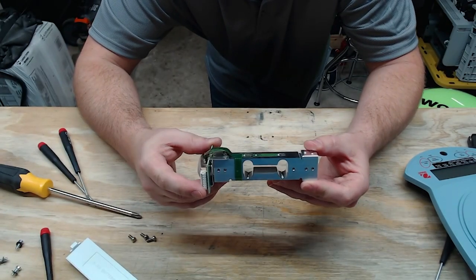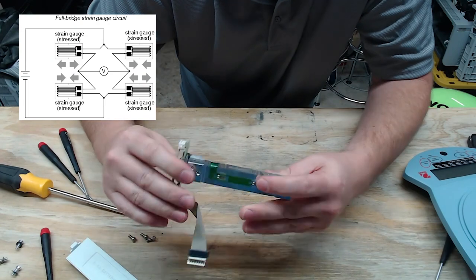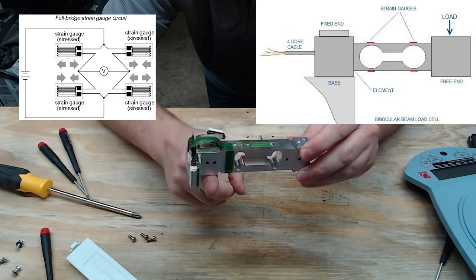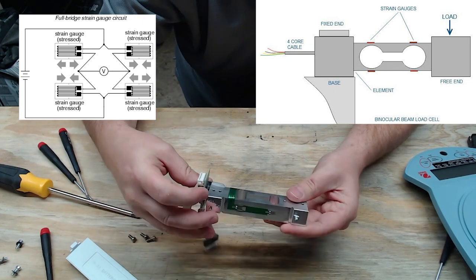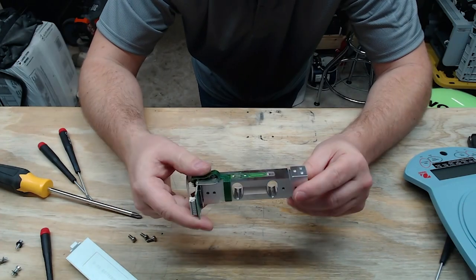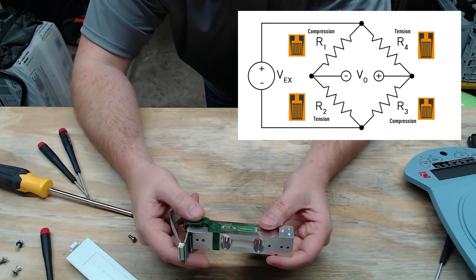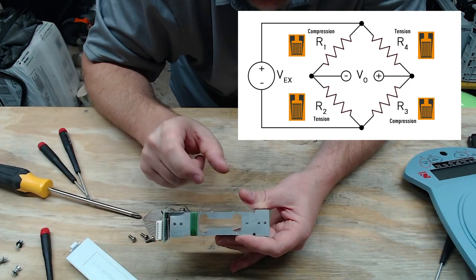This is a fully functioning load cell, and what we have here are strain gauges — here, here, here, and here. You can see it has that dog bone shape. As you place a weight on one side and the other side is anchored down, it creates compression on one side and expansion on the other, with the reverse on the opposite side. This gives you four points of measurement, which provide a very stable reading and a lot of resolution. These load cells use a circuit called a Wheatstone bridge, where you balance adjacent corners for expansion and compression.